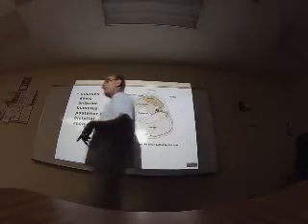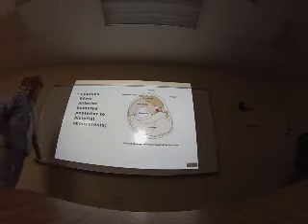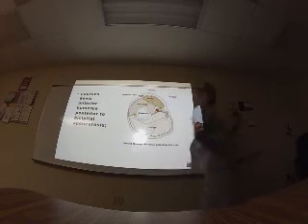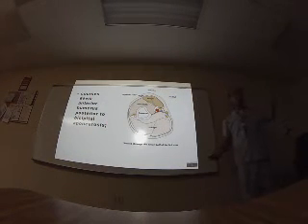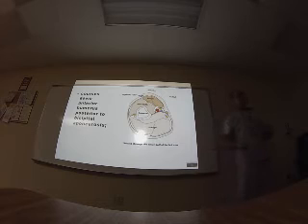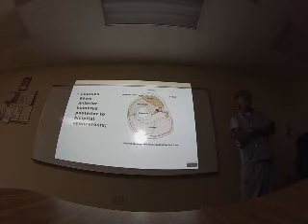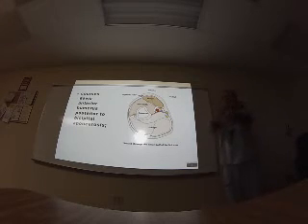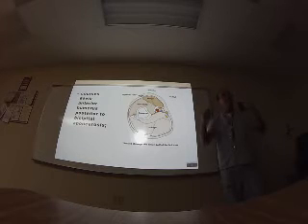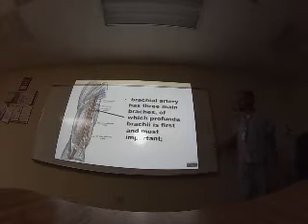This is not as important as the femoral, because arterial of the upper limb is a very, very rare protocol. Very little. I worked 10 years in a hospital, and I scanned arterial four or five times. It's something that doctors don't need. Because if there are problems in the arteries, you can suppose how bad the arteries of the legs are. And in very old people, in general, they ask very little for arterial. They ask for venous of the upper limb sometimes because they need veins to put needles. But in general, the lower limb is more important in vascular than the upper limb.